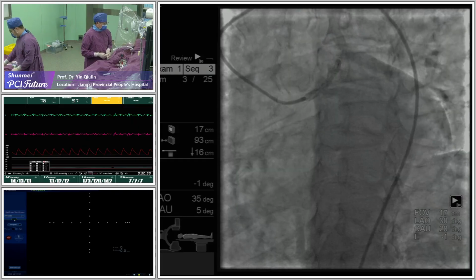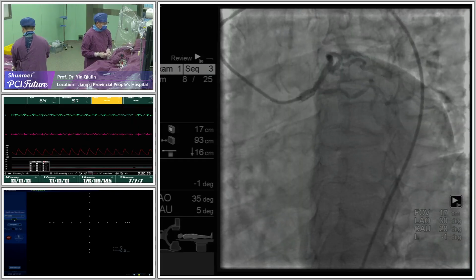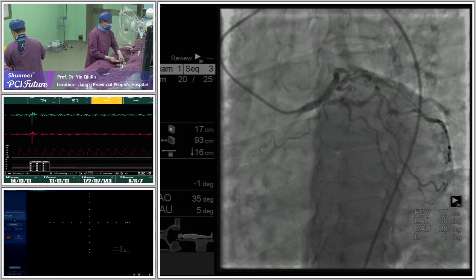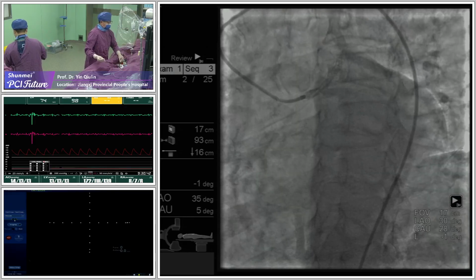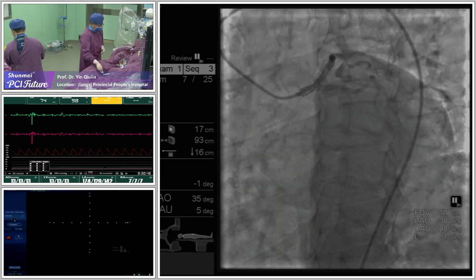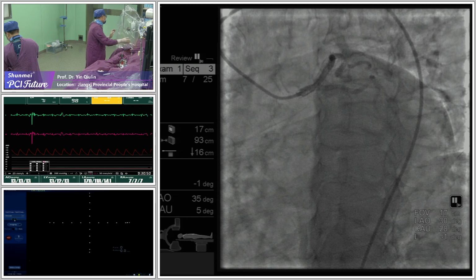I just wanted to mention that, like Dr. Avram said, first of all, the microcatheter and the wire are floating in the air, so it's not fixed. I would be very careful not to penetrate some side branch, because I think the microcatheter and the wire are not in the architecture of the stent. This is some side branch, in my opinion, from the beginning.